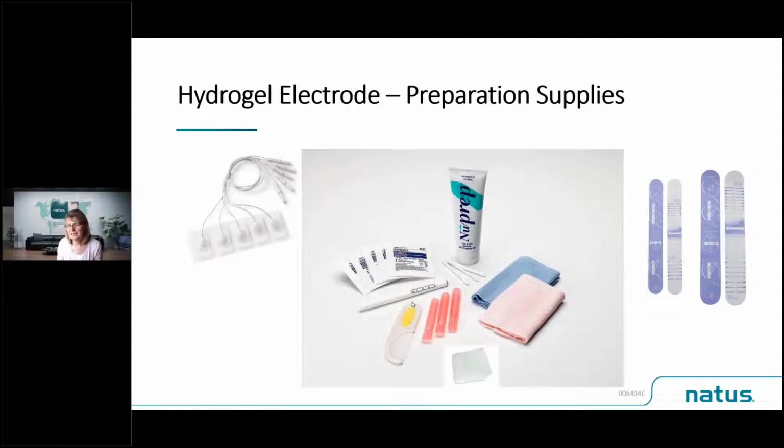And if your baby has got an abundance of hair, then maybe you're going to need a comb, or my tip and trick is a toothbrush. And when I change the video cameras shortly, I'll show you exactly what we mean by that. Because a toothbrush makes a really great baby hairbrush, especially when it's dipped in water. So the other thing just to mention, optionally, you can choose to use a wrap hat. I'll show you how these work just now, and that will help to protect the electrodes as well.